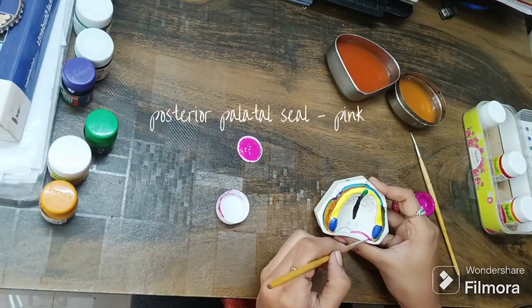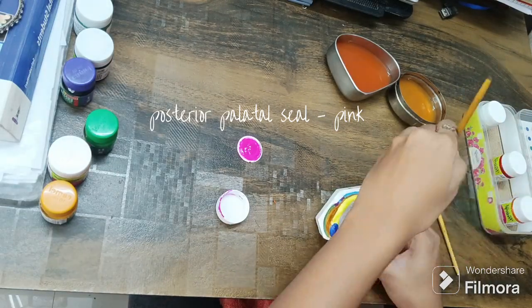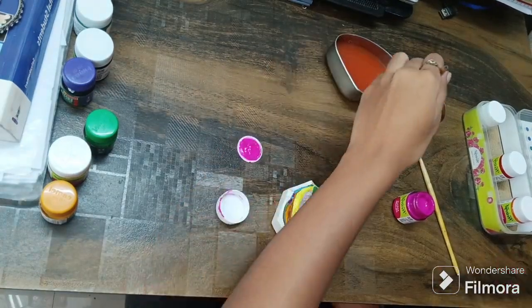This pink color is used for the posterior palatal seal. It is a limiting structure — also referred to as the peripheral seal structure. I hope giving two coats would be nice for this structure.